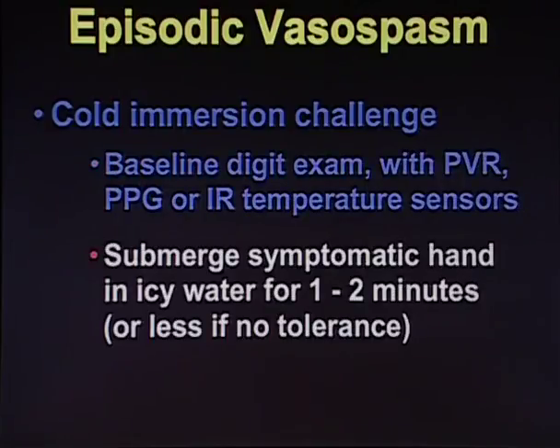We submerge the hand in ice water for 1 to 2 minutes. If you look at the older literature, they'll say for 5 minutes, but most people can't tolerate this. In fact, most people can't tolerate even a minute or two in ice water to chill down the hand. For this reason, one of my methods is to put the hand in cold water and then add the ice afterwards, so it's not quite as intimidating to the patient to see these small ice cubes floating around and having the hand plunge into the cold.